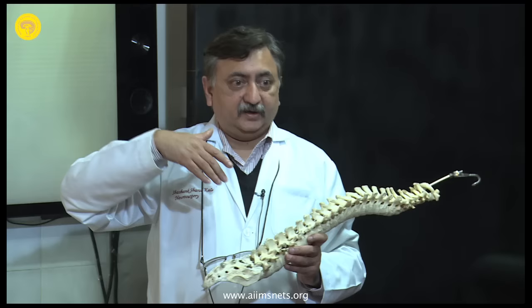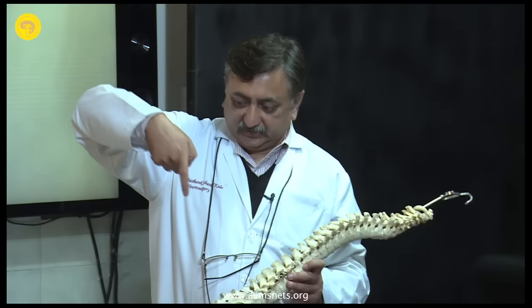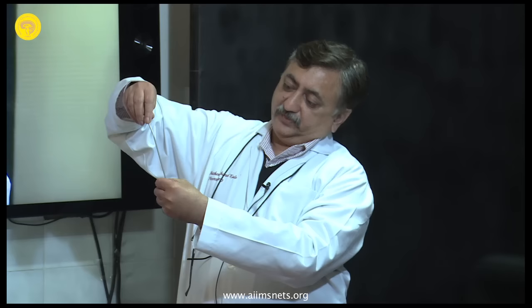Always use the sound and scrape the walls. It's like you put it in a hole, because this is your hole in the bone. You put your instrument in and scrape the wall from below upwards. You start from here, this way, scrape it. Or if you're on the other wall, scrape the other wall. Yeah. This is the sound.